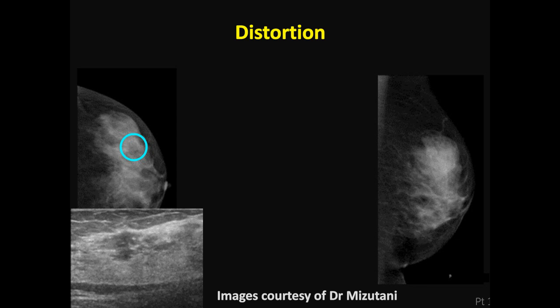Perfect. Okay, and then we'll just take one last question: how do you handle imaging women during their cycle? So we do not time our contrast mammo exams according to cycle, and in fact, we do not do that for MRI as well.